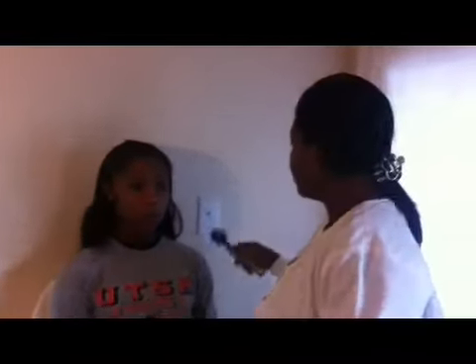Okay. I'm moving on now to the fundoscopy test. And basically what I want you to do is just look straight ahead at the marking on the wall.